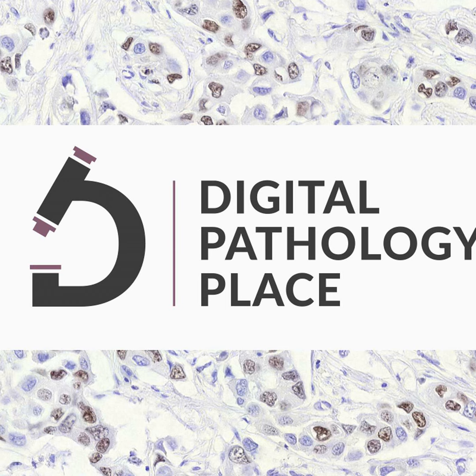This paper is from the Journal of Pathology Informatics, and this group is from Moscow, Russia. We're talking about LVI-PathNet, a segmentation and classification pipeline for detection of lymphovascular invasion in whole slide images of lung adenocarcinoma. What happened here is they decided that they're going to quantify lymphovascular invasion. Why in lung cancer? Because this is a significant prognostic factor.